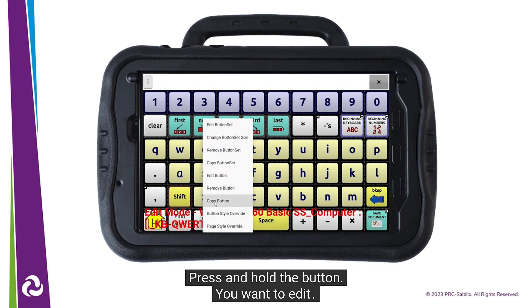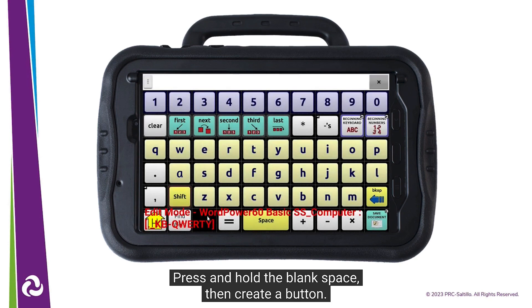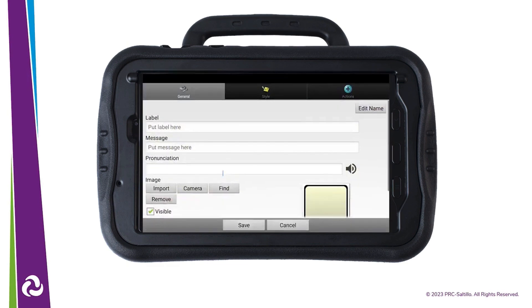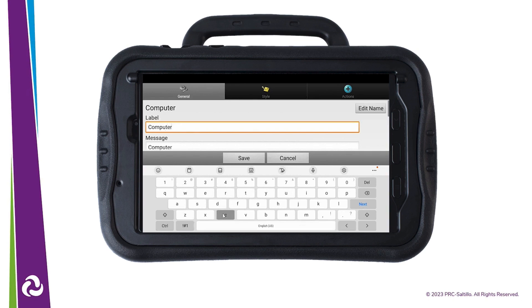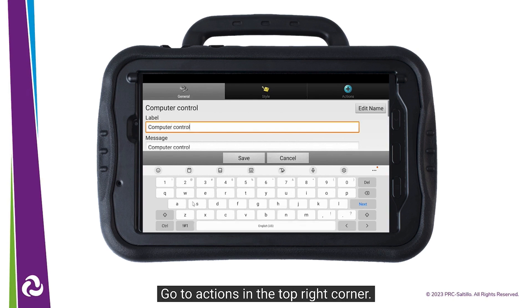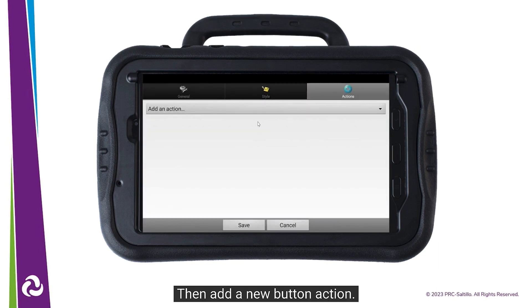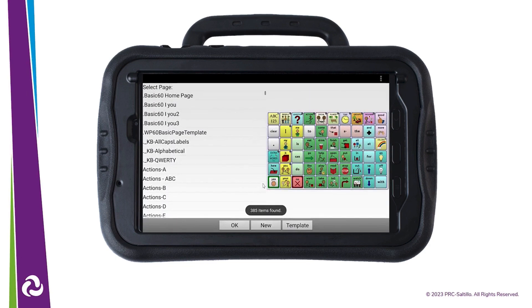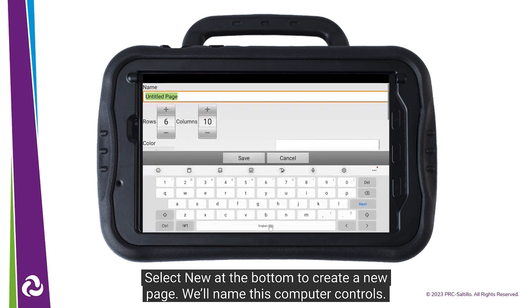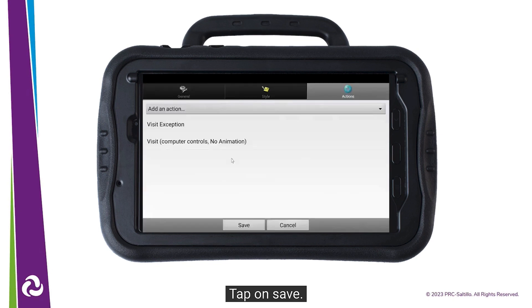Press and hold the button you want to edit. Let's remove the current button set and start with a brand new button here. Press and hold the blank space, then Create Button. Give the button a label like Computer Controls. Then we need to change the button action. Go to Actions in the top right corner. We want to remove the Speech Message action, then add a new button action. This button will take us to a new page where we will add our computer controls. Scroll down to Visit. Select New at the bottom to create a new page. We'll name this Computer Controls. Tap on Save, then tap on Save again.